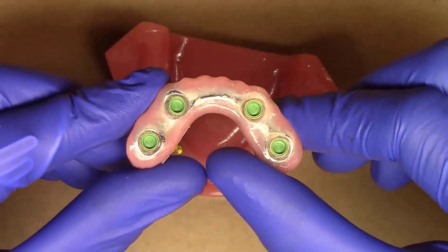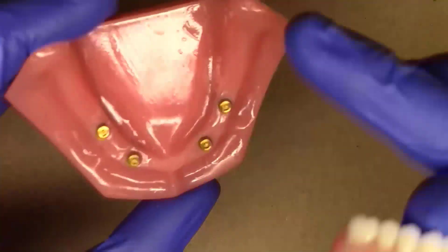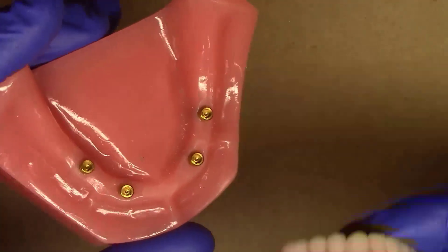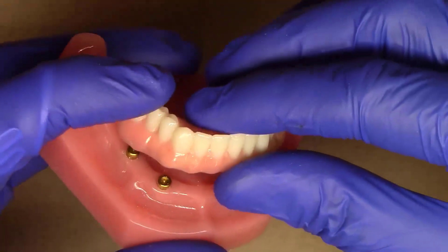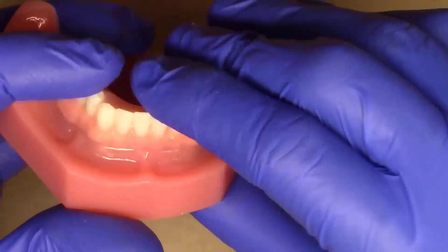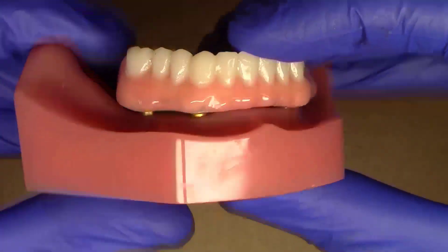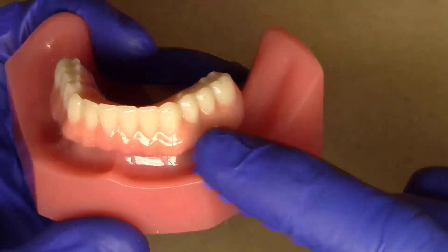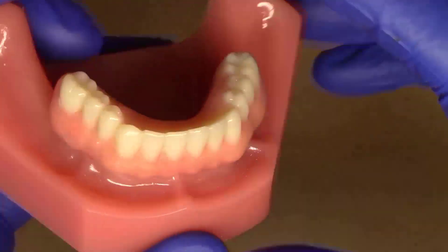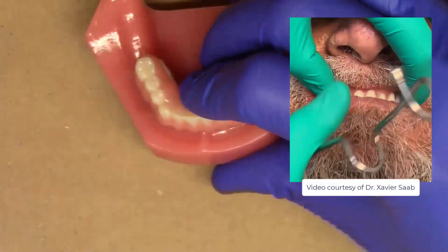When we take our locator fixed prosthesis, we now have our flangeless prosthesis in the shape of a hybrid restoration. We have our Zest locator abutments in place in approximately the molar and canine position. When we take our prosthesis and we're ready to seat it, we place it into the mouth and find where it just wants to grab. Then I take my fingers and really squeeze until I feel it pop into place. Now I've got this side fully seated, but this side may not be fully seated just yet. I recommend having the patient bite into occlusion to see if that will cause it to seat down all the way.